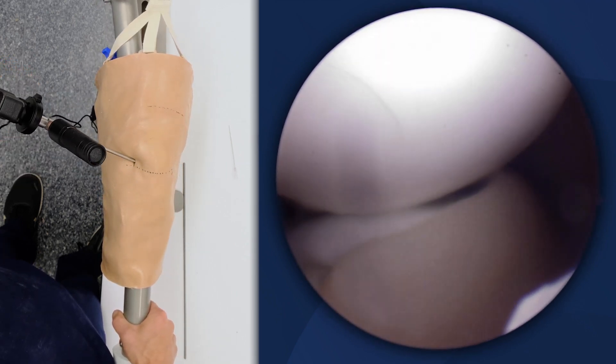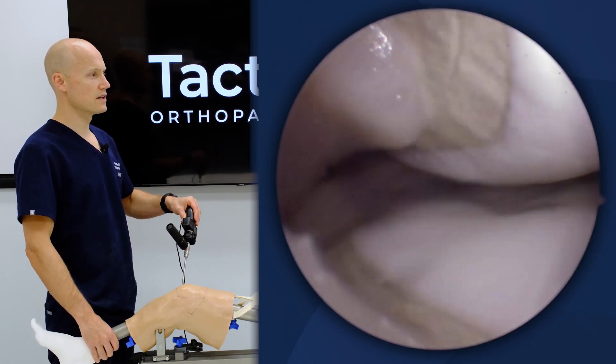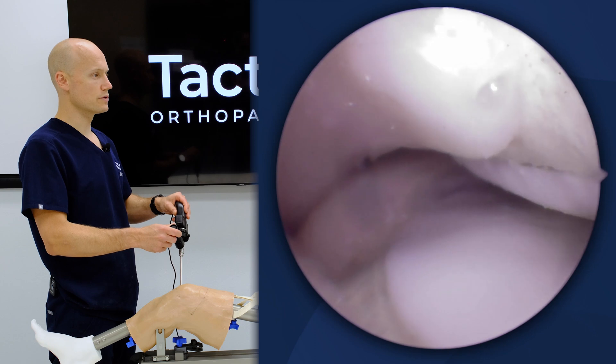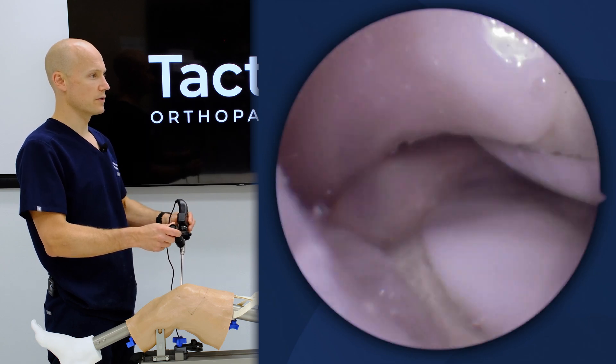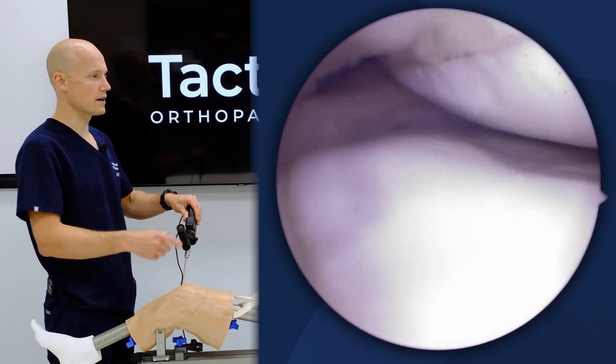In full extension, you can see how anterior the medial meniscus attaches, and we can come along and see the posteromedial meniscus root there with the part of the PCL attaching on the femoral condyle.